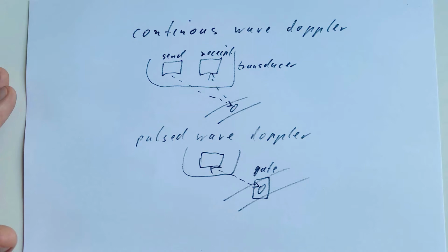How are we able to do this? With the knowledge of the speed of the wave and the medium, we should get the duration. So the crystal sends one wave and waits until the wave comes back from a defined depth. That's all actually. The main benefit over the previous technique is the accuracy, but the disadvantage is the mentioned limited flow speed.